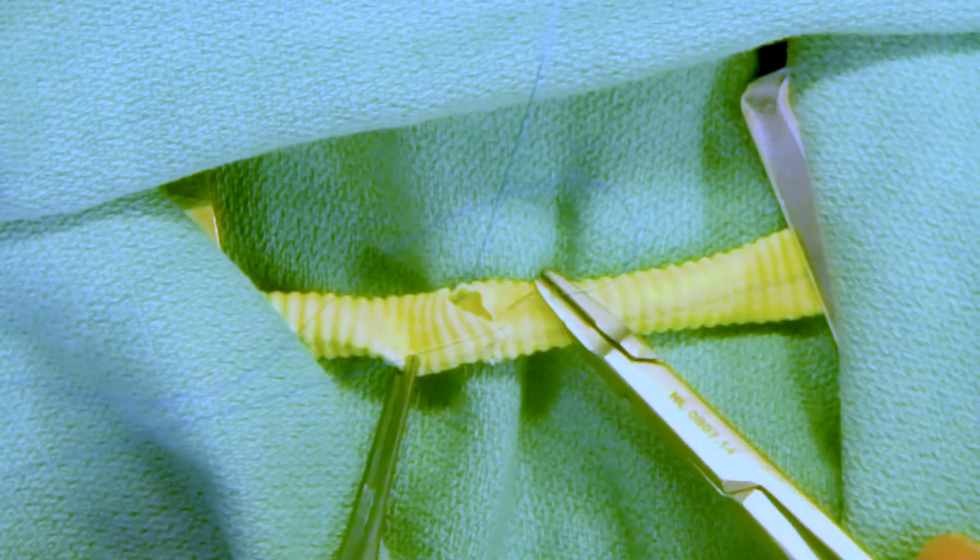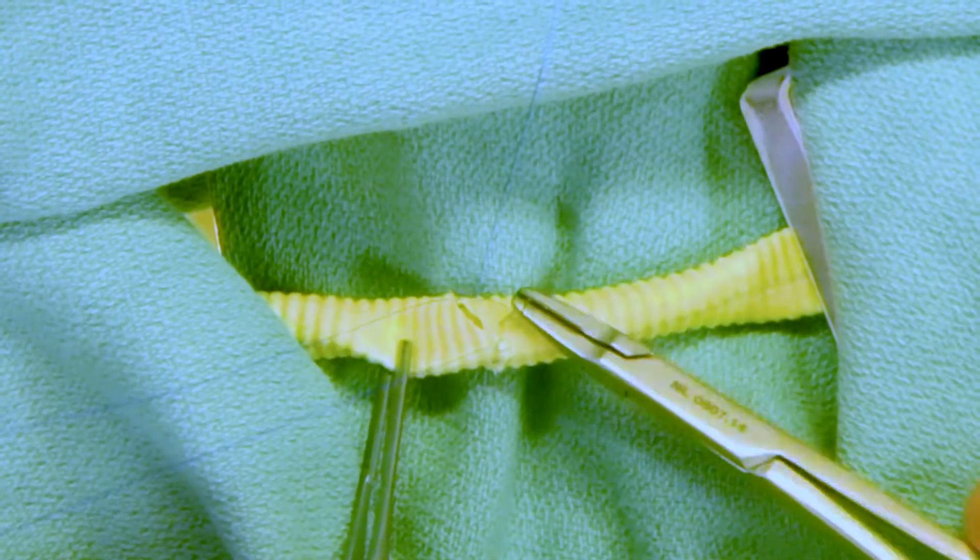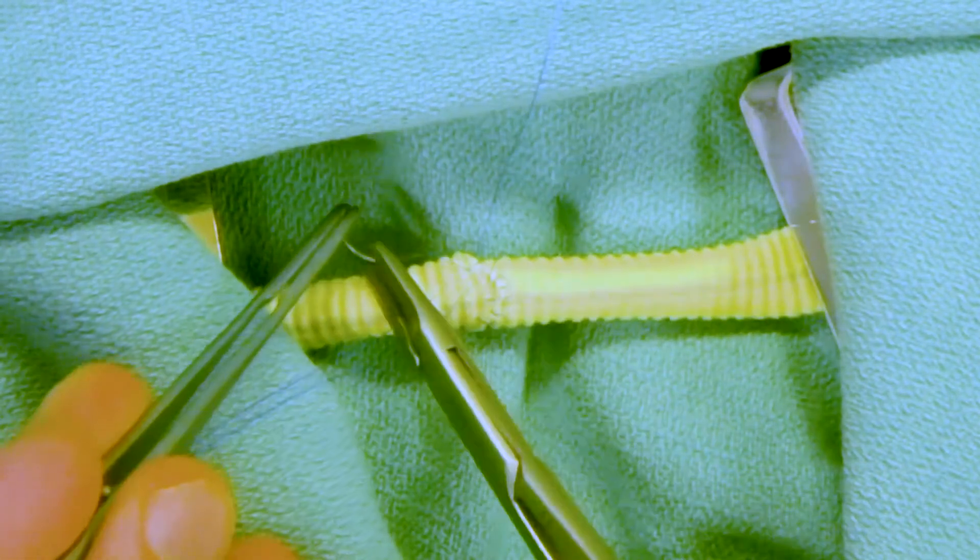Notice as well that to expose the edges of the vessel for proper suturing, many times you don't have to grasp the actual edge of the vessel wall. And in fact, you can grasp the middle of the vessel and distract the two edges apart by rotating that one way or the other to get it exposed.